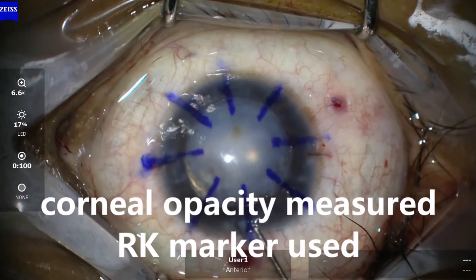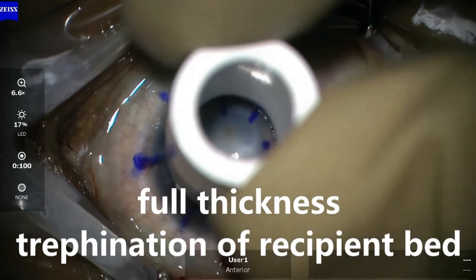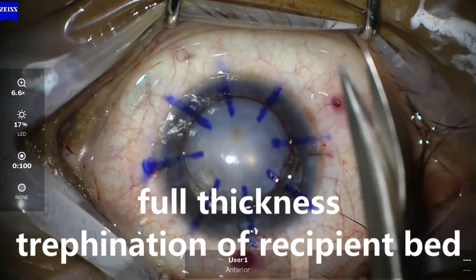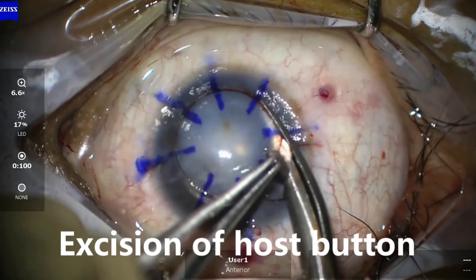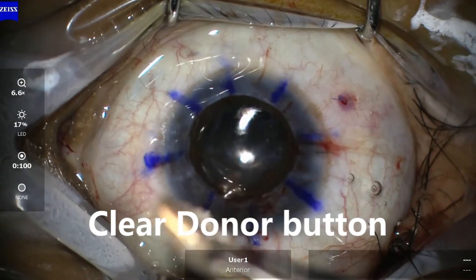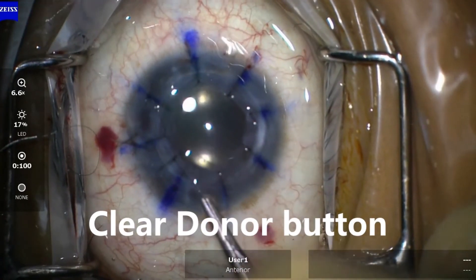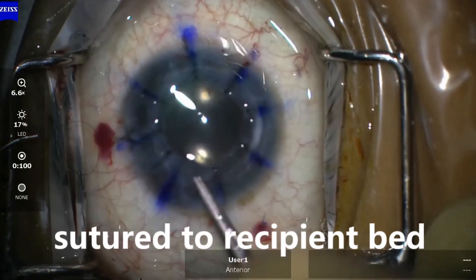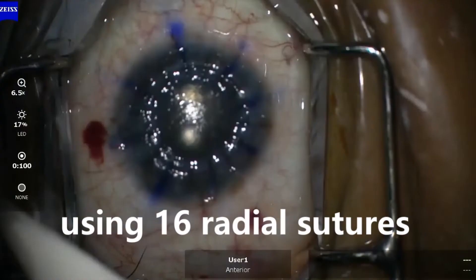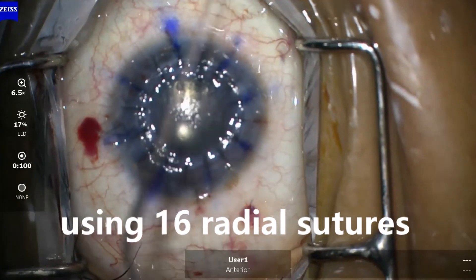Recipient bed was measured using an RK marker. Full thickness trephination of the recipient bed was done. The donor button was sutured to the host bed with 16 radial sutures. Six weeks post-operatively, the patient was doing well with BCVA of 6/36 and N12.